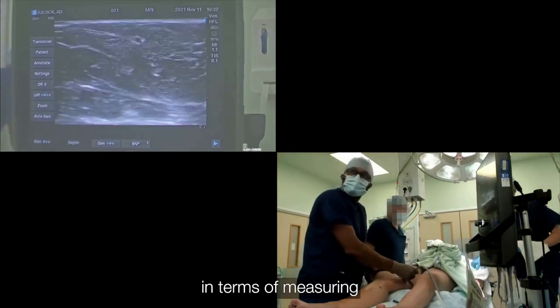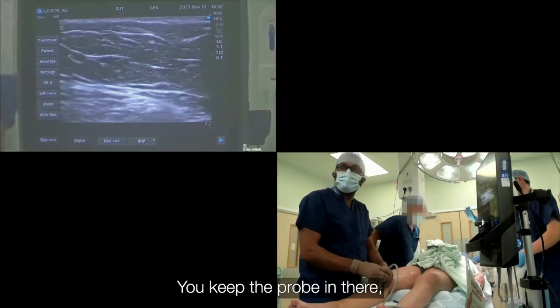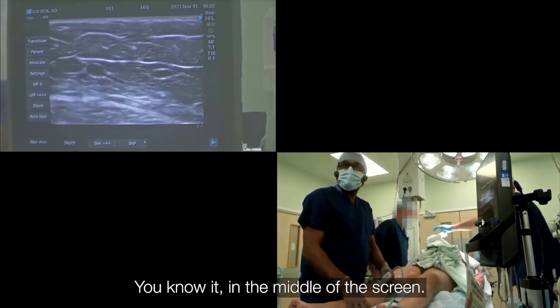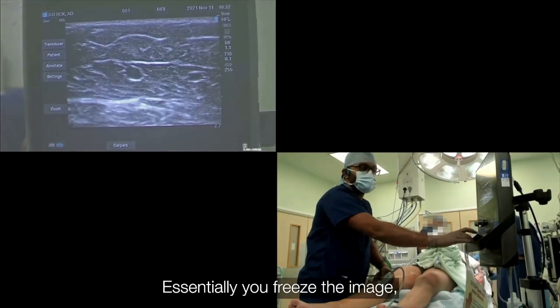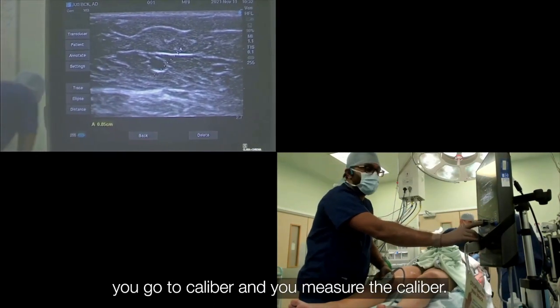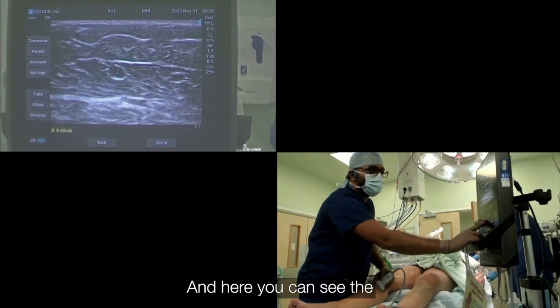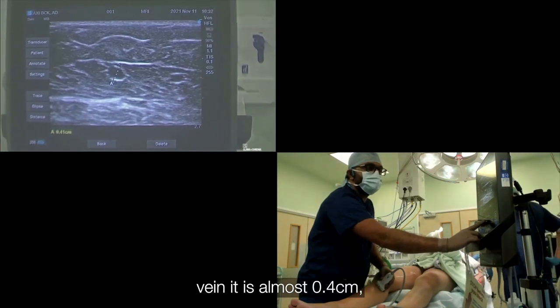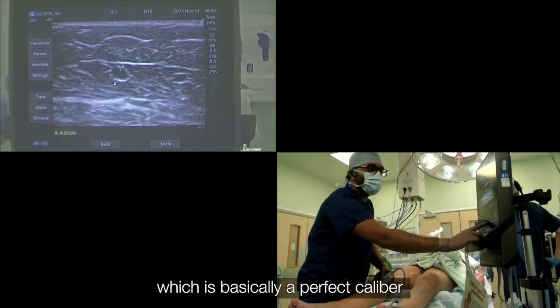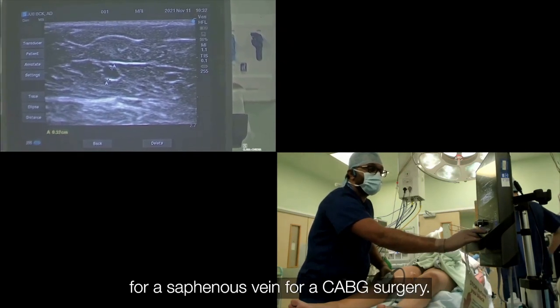In terms of measuring the caliber, it's very easy. You keep the probe there with the vein in the middle of the screen. You essentially freeze the image, go to caliper, and you measure the caliper. Here you can see the vein is almost 0.4 cm, which is basically a perfect caliber for a saphenous vein — a perfect caliber for CABG surgery.